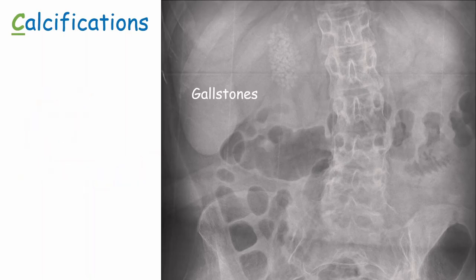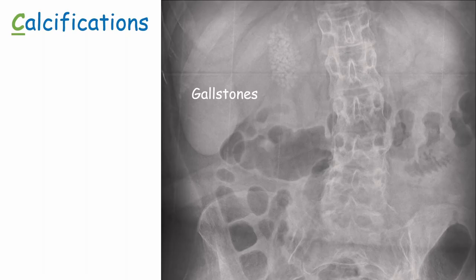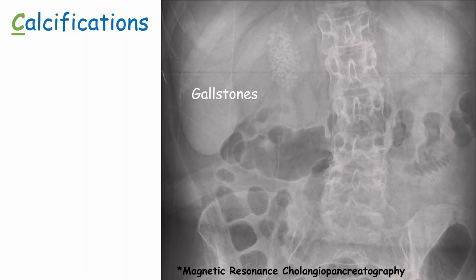Gallstones sitting in the gallbladder can appear as calcification. However, gallstones aren't usually visible on x-ray as they are most commonly made of cholesterol, which isn't radiopaque. Less commonly, they can be made of a mixture of bilirubin and calcium, which is radiopaque and therefore visible. Abdominal x-rays aren't the best imaging choice for gallstones - we typically use ultrasound or a more specific test called MRCP.